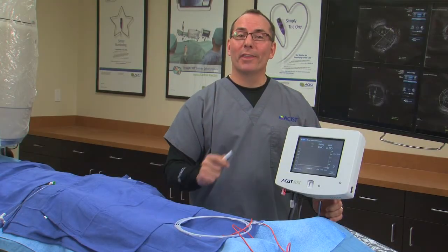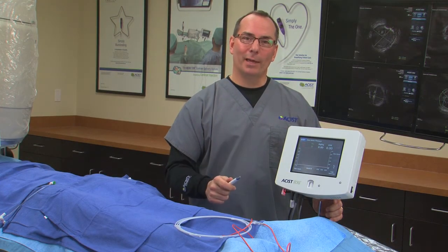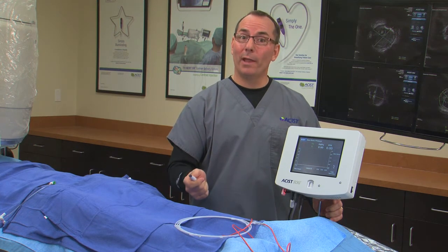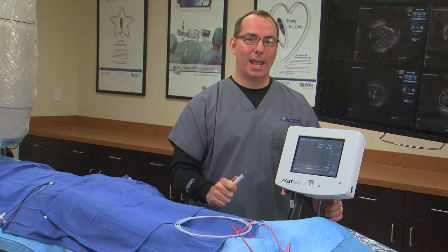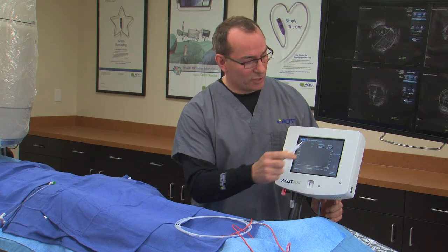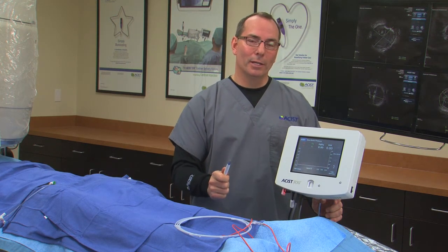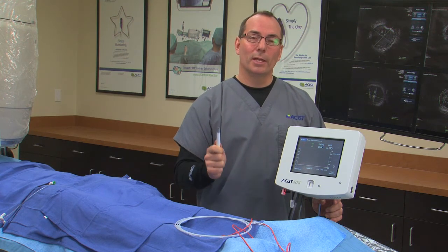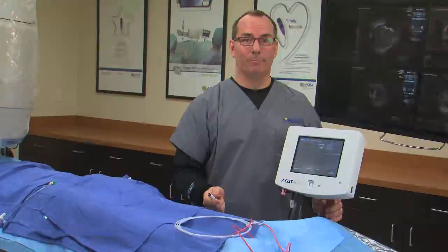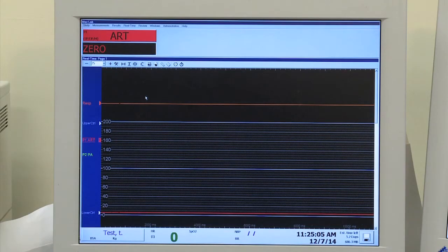The first thing we need to do when we bring the RXi system into a cath lab is zero this system to match or pair it with the hemodynamic system. So we simply hit the zero aortic button. However, we have to ensure that the hemodynamic system is reading a zero pressure at that time. Our RXi system is now connected via our cables to the hemodynamic system.